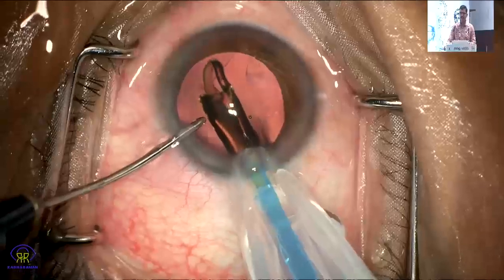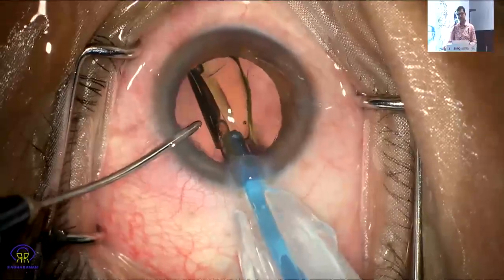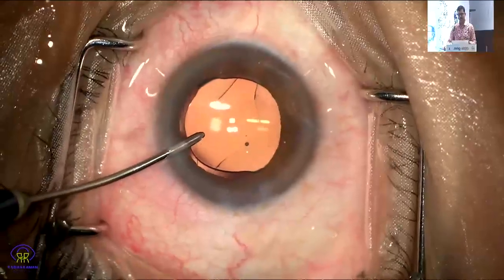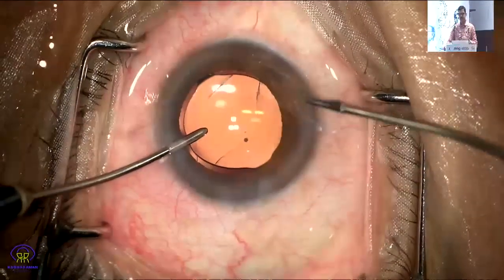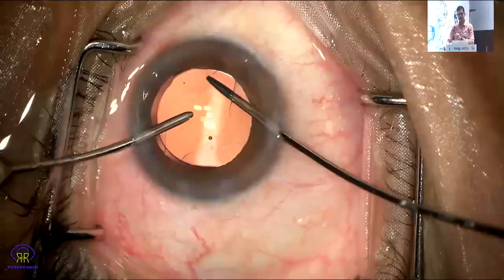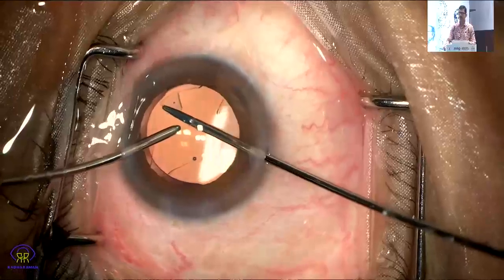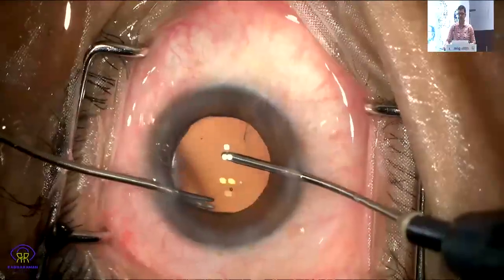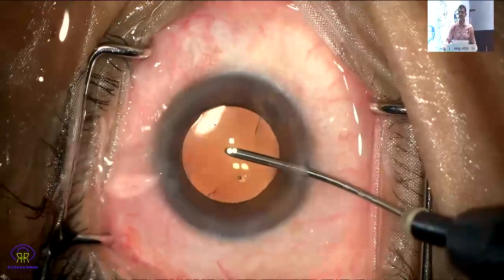Now after I have a bag, I still have enough support for this single piece IOL to go in. So I put in the Vivinex Impress in this case. What I mean to impress here is that, come whatever the situation may be, whatever compromising situation it might be, and then I just expand the rhexis because I thought the opening was too small, under cover of BSS on both sides.